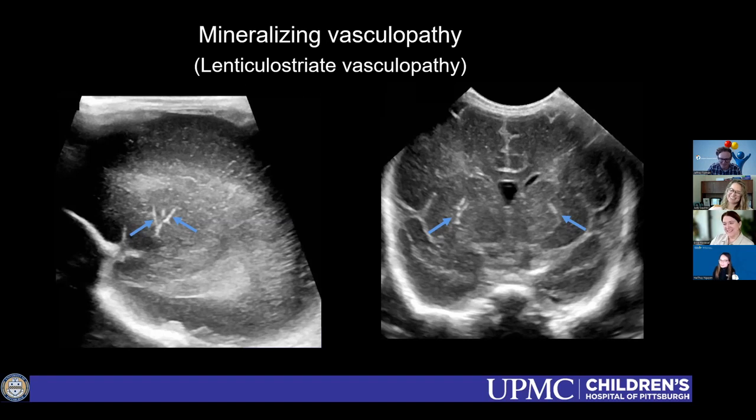Well, our neuroradiologists tend to say that is normal, unless it's too much, but they've never really said how much is too much. So once again, I would love to hear your thoughts on that. Like, what is too much? I've never actually seen them on a follow-up MRI. If a baby has an MRI for some other reason for follow-up, I've never seen the correlate.